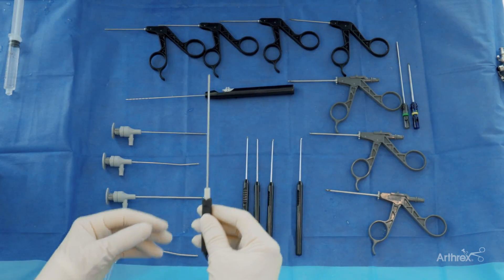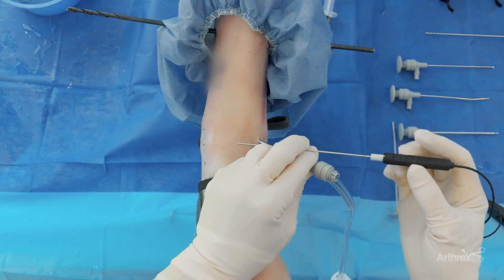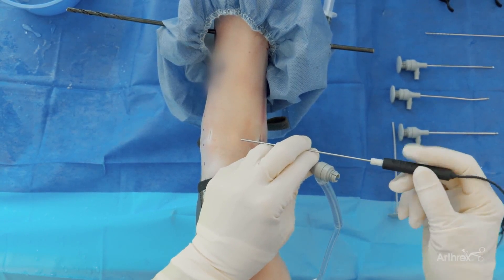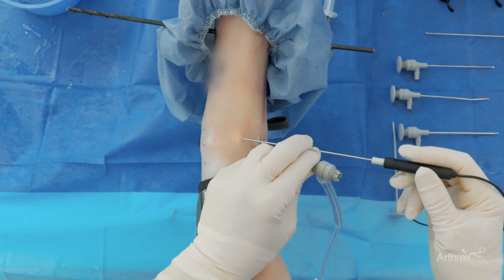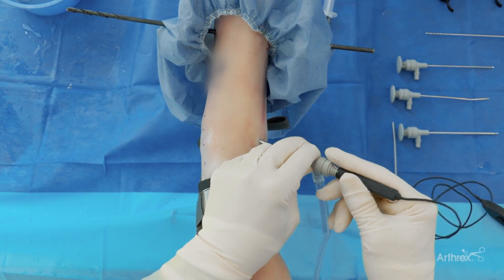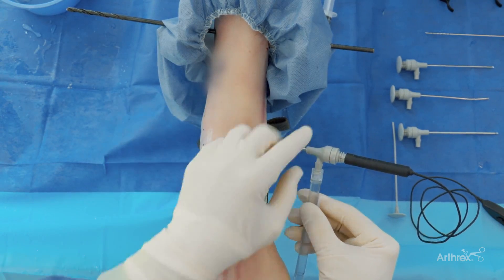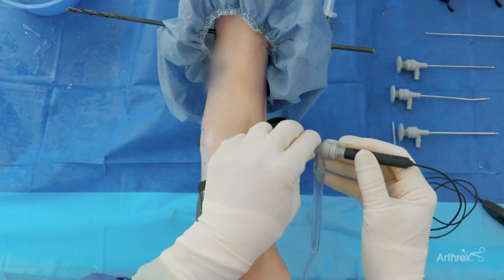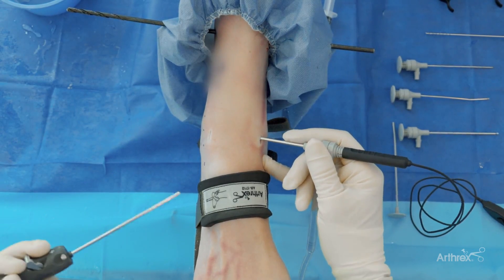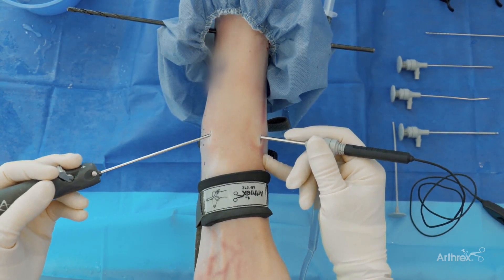That's what we're talking about when we say the nanoscope. Traditionally, positioning your handle with an arthroscope you've got buttons and such. They've oriented this with a flat spot with a few ridges, and that's basically going to help you with orientation. I usually place my finger there and just rotate. I like to still have this kind of looking up with the tibia, same thing with a regular scope. Wherever you have this position, you're basically looking. The curve goes this way, just like a regular scope.